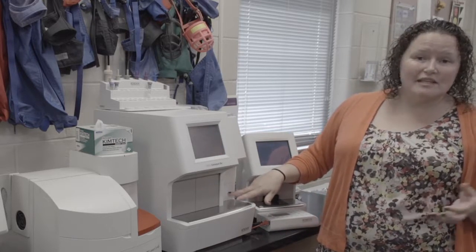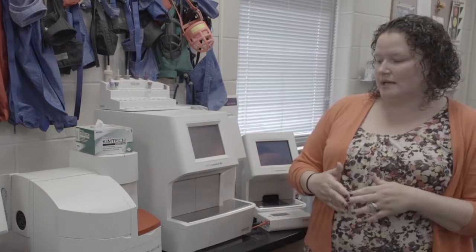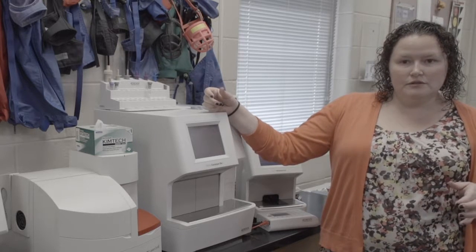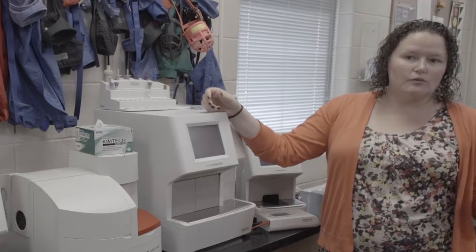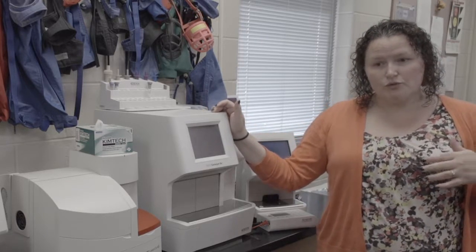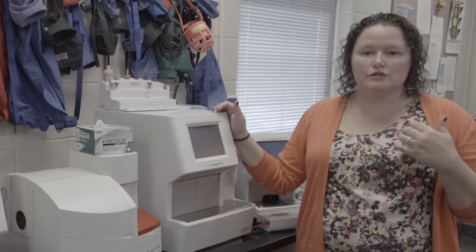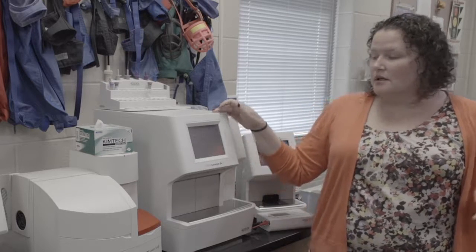Best practice is just keep this drawer full, and then you don't have to worry about it when you're going to run multiple samples at a time. The consumables for this analyzer live in the freezer. You have clips, and it depends on what you guys have ordered. A Chem 10 would be similar to a pre-anesthetic panel. A Chem 17 would be similar to your diagnostic profile, and then you have your electrolytes and your individual slides.